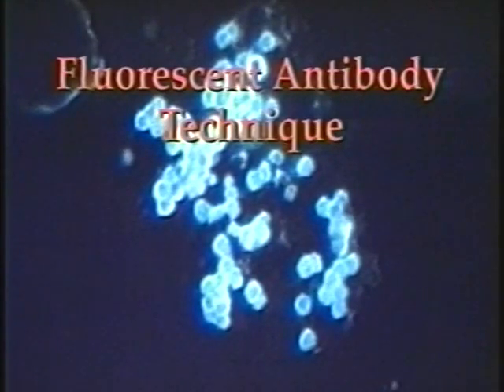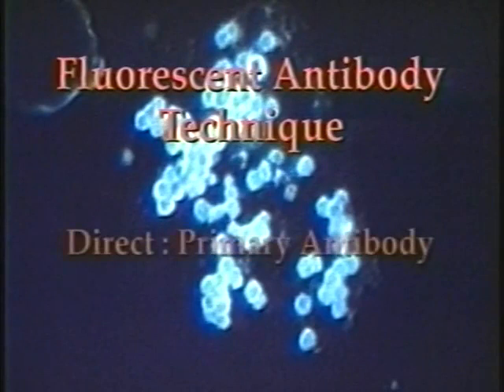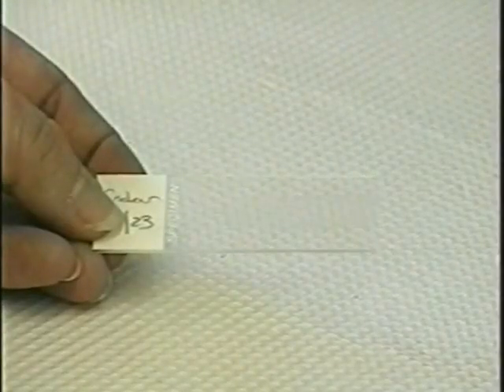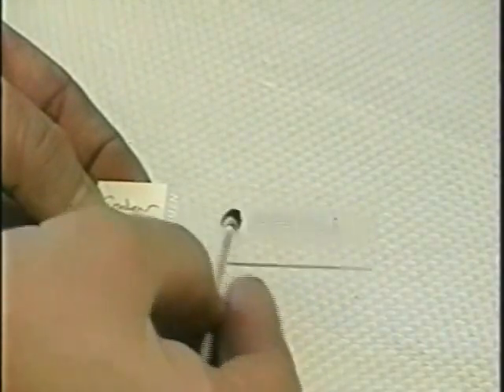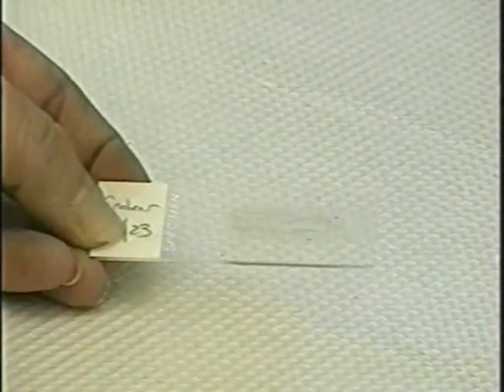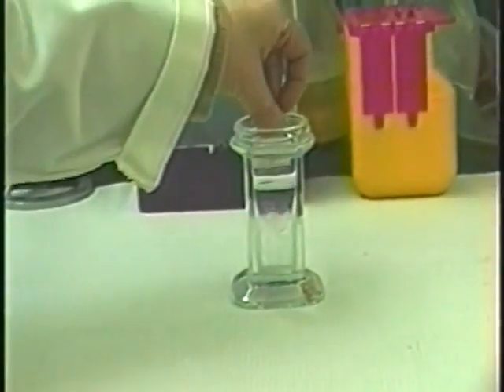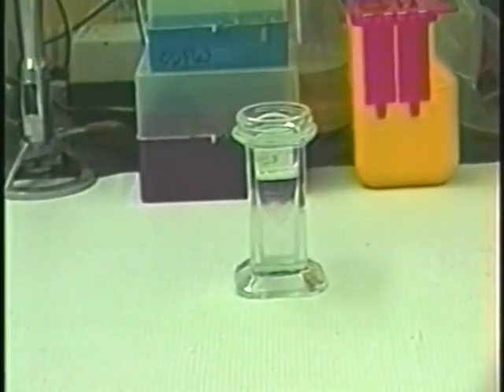The test can be conducted as a direct test, or DFAT, with the antibody against the bacteria conjugated with a fluorescing dye, or as an indirect test, or IFAT, where a secondary conjugated antibody is used. To perform a direct FAT, prepare a smear of bacteria from an isolated colony, or use a smear taken from the kidney or a lesion. Allow the smear to air dry and fix with heat or methanol.